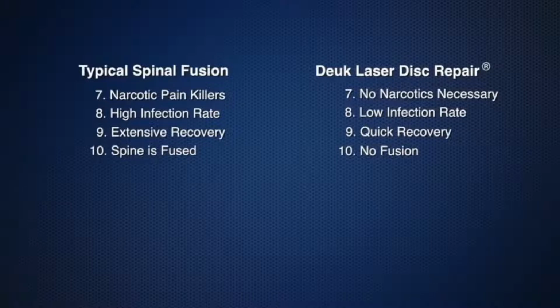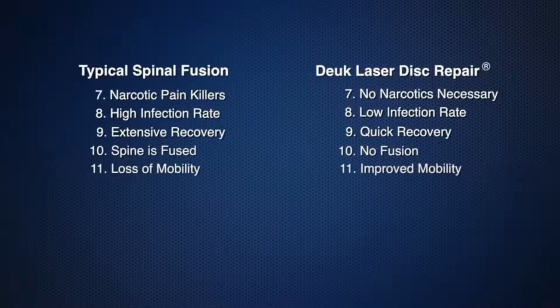Normal movements of the joints in the spine is preserved. Spinal fusion results in loss of mobility. There is no mobility loss with the Deuk laser disc repair. In fact, most Deuk laser disc repair patients experience improved mobility after the surgery.